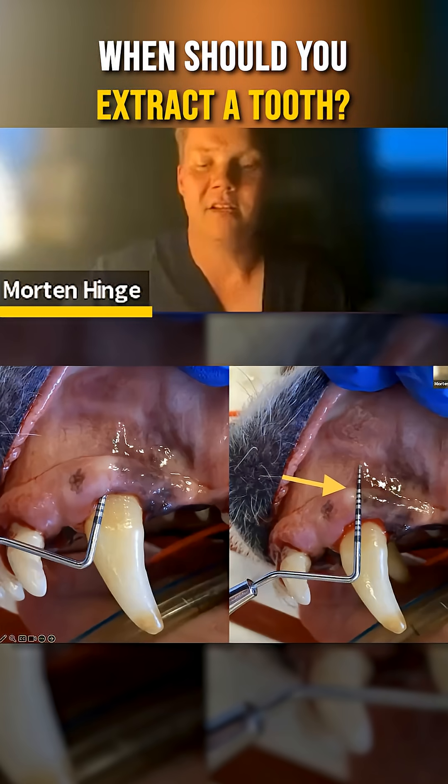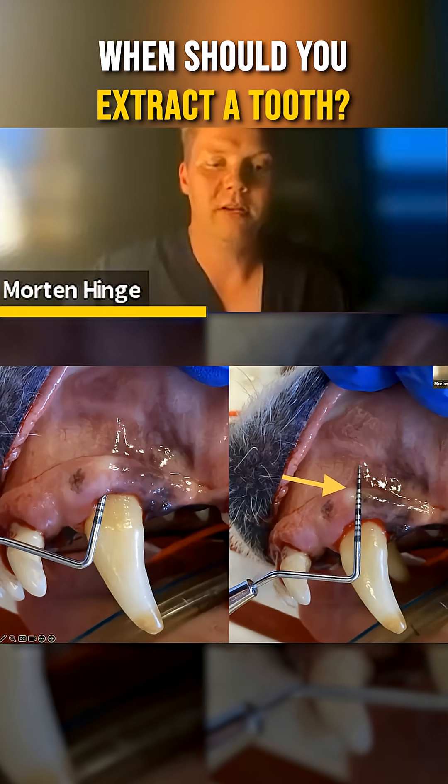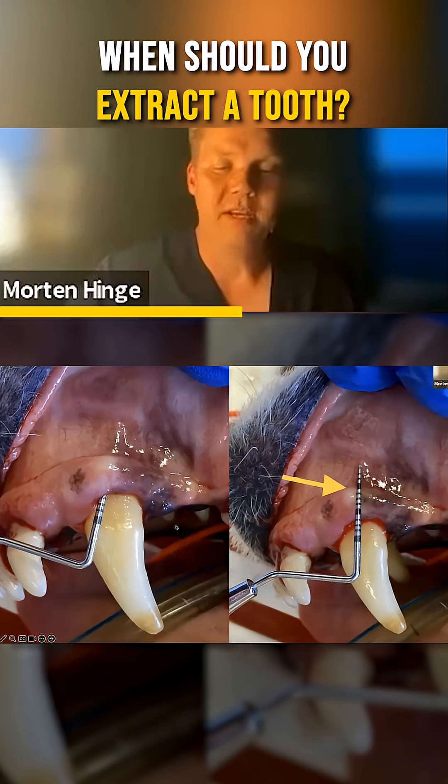Another rule of thumb: if your periodontal probe goes all the way beyond the muco-gingival line — up into the mucosa, as you can see here — then you have to extract. I know it's a pity; it's a nice-looking canine tooth, a big tooth, and you want the dog to keep it.